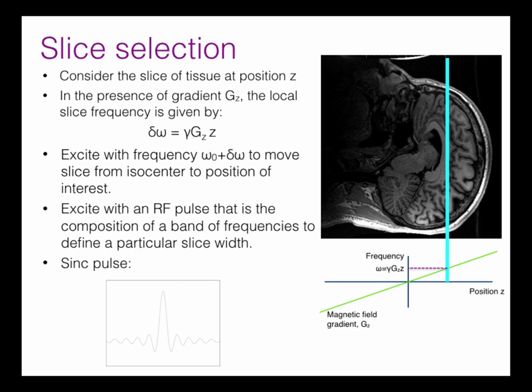And what that band will do is, because NMR is a resonant phenomenon, unless you hit it pretty much bang on the frequency you want, the spins will ignore you. So if you hit it with this band of frequencies, all the spins that are inside this plane represented by this line, the plane that goes into the board, will be flipped over just like they were before when we were just dealing with that bulk magnetization vector. Okay, and all the spins out here will be unaffected.